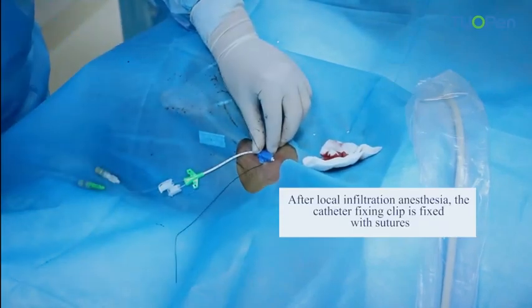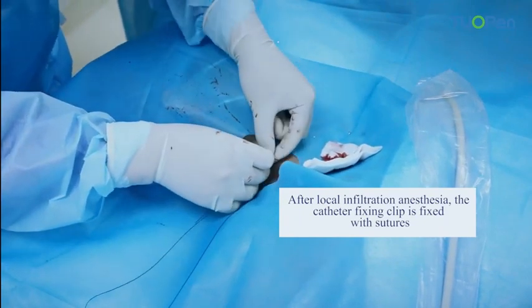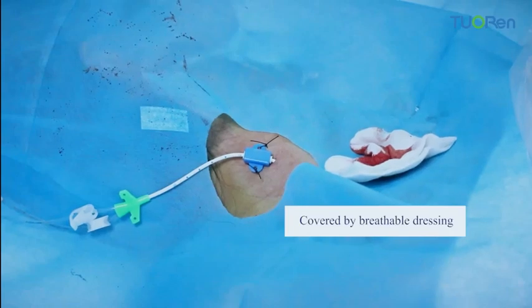After local infiltration anesthesia, the catheter fixing clip is fixed with sutures. Covered by a breathable dressing.